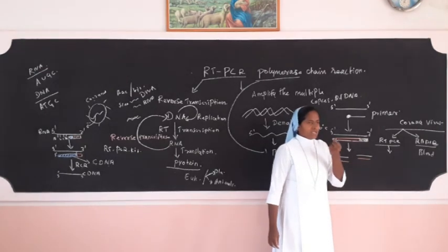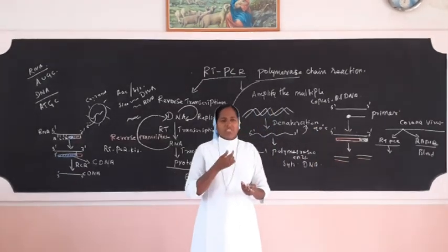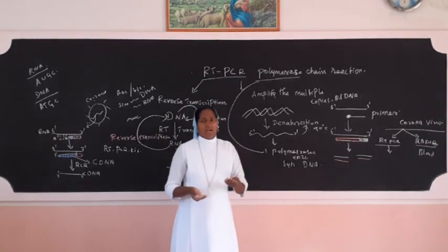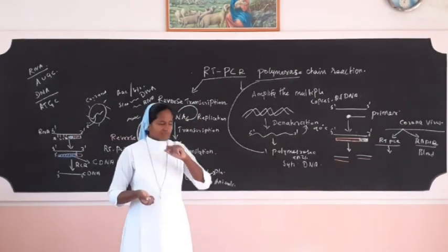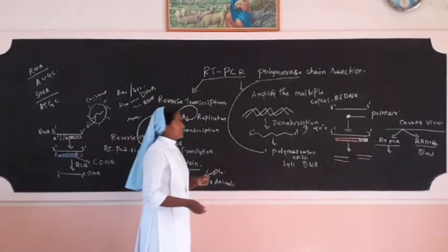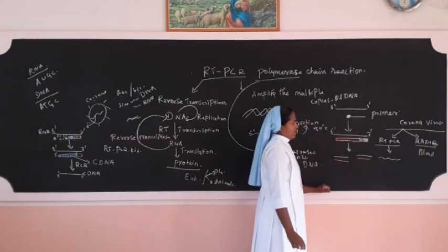We can take the sample that contains in those areas, because these viruses are able to survive in the respiratory tract. So those mucous substances or sputum or any thick solution present in the nasopharynx can be taken using a swab, like cotton buds, that we can apply and take those substances. And then we add different types of chemicals to separate this particular RNA strand from those samples.